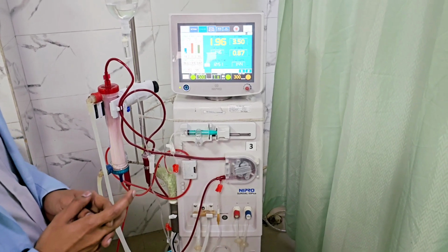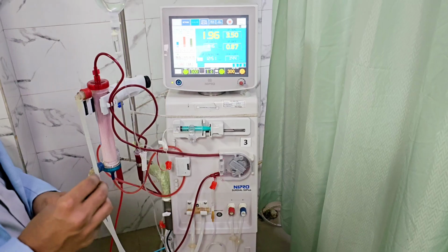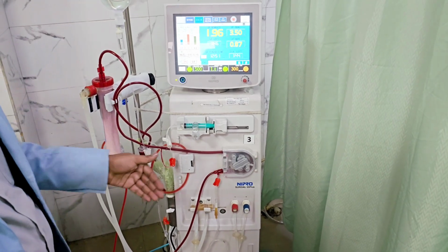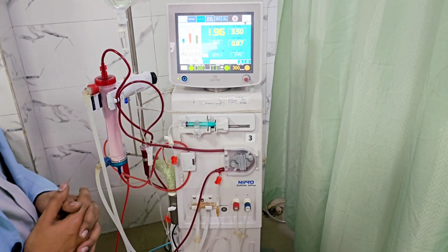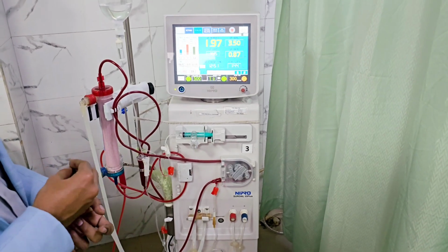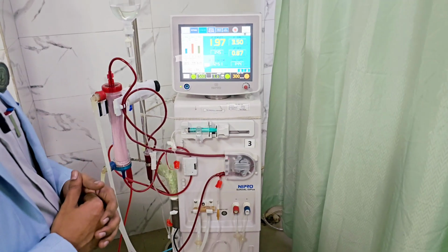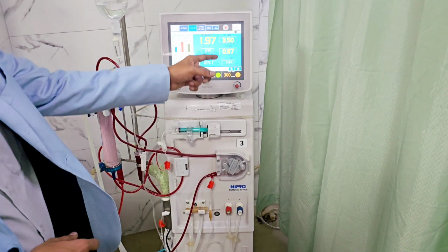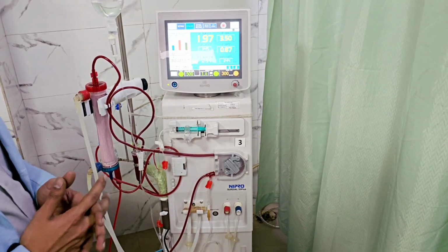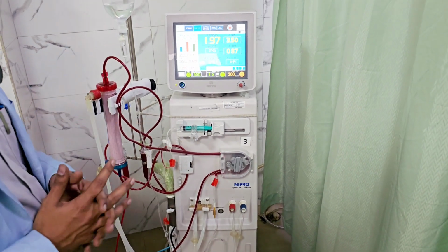This has to be done every 30 minutes. For example, if every 30 minutes this much ml of normal saline we are using to dilute it, yes, the clotting risk is less, but the patient will receive a net amount of more water in the form of normal saline. That has to be adjusted in the ultrafiltrate. The total ultrafiltrate achieved has to consider this also.